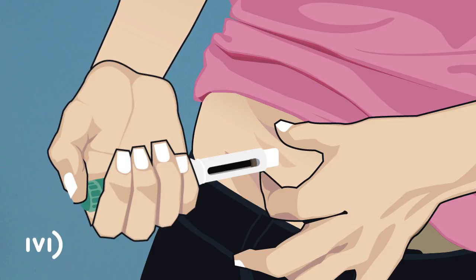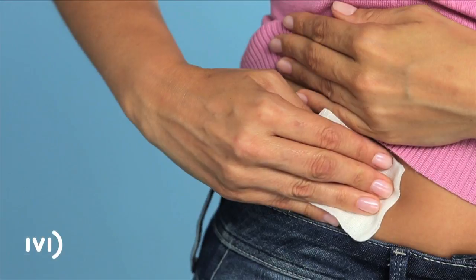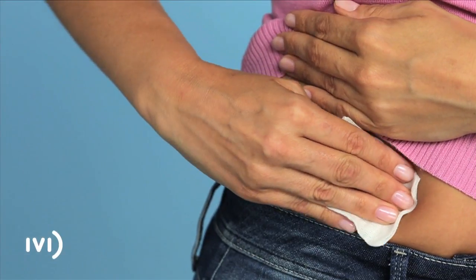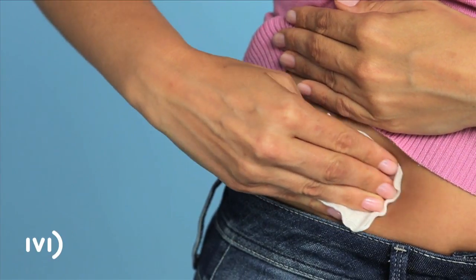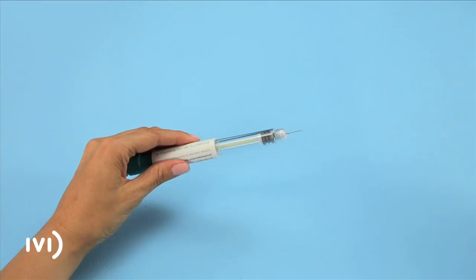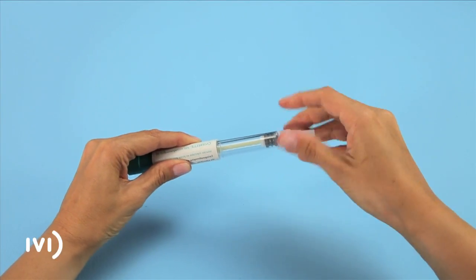Next, let go of your skin and pull the needle out gently. Press down on the area for a couple of seconds with the gauze while massaging it lightly so that the solution disperses under the skin. Finally, put the external cover back on the needle and unscrew it.